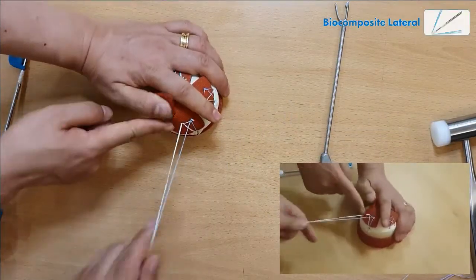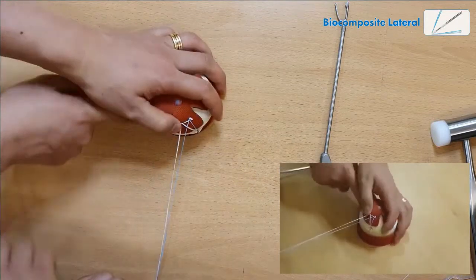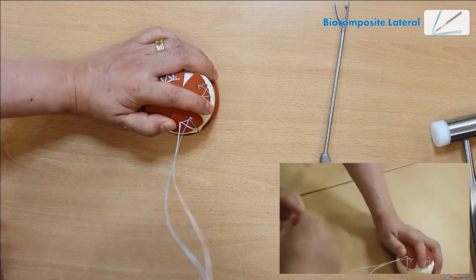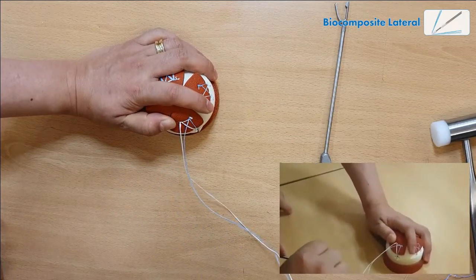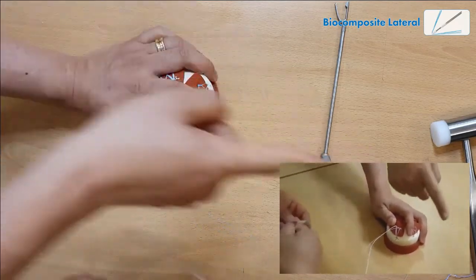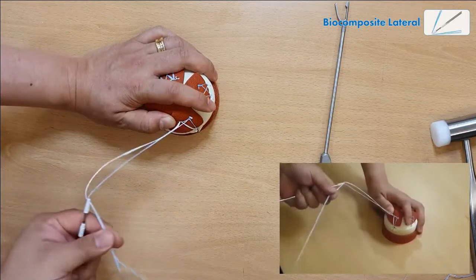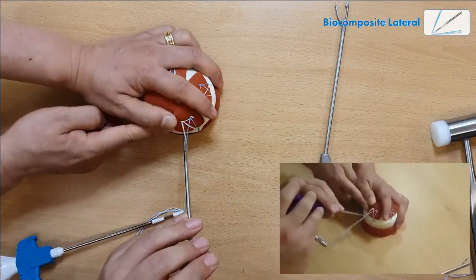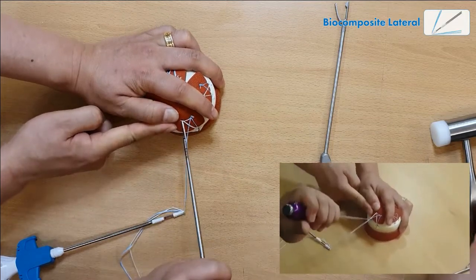And the second one, I'm going to use the biocomposite medial anchor. Now this one, you need tapping. Just tap it to the second index mark.